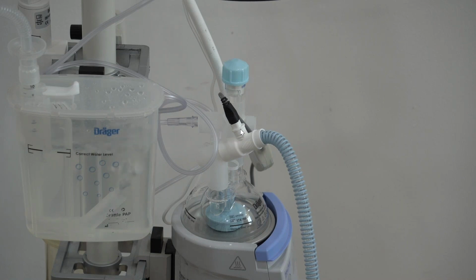I completely agree with you, and if I had to give this answer, I almost would say, well, you cannot, because this is a very simple system to generate the CPAP. If you want to be able to measure the CPAP and the tidal volumes that are delivered to the patients, and all of these quantitative parameters, then you would need to use the high-end machine that has the pressure valves, the volume flow sensors, and the monitoring possibilities, and that is a lot more complex machine.